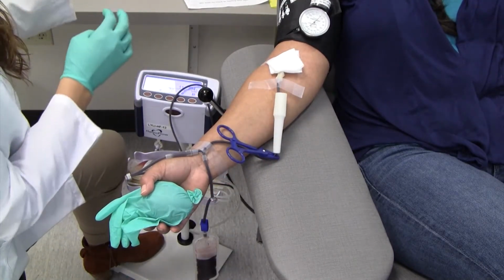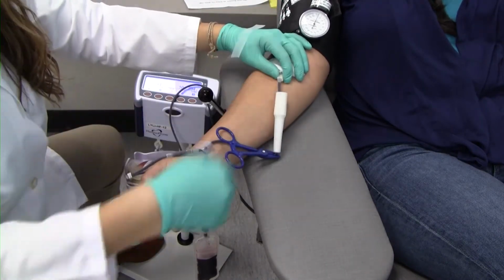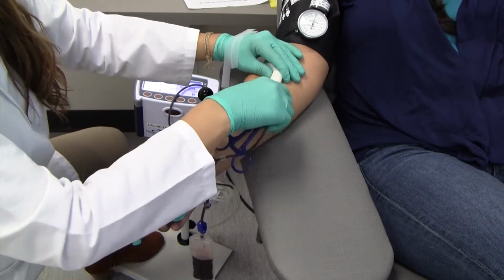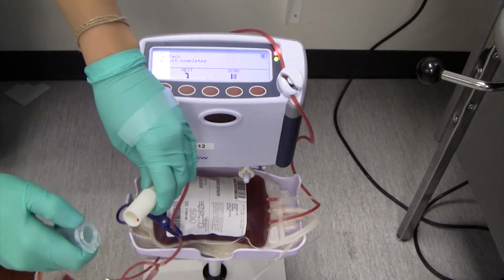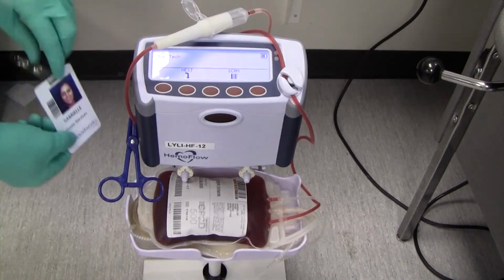Release pressure on the donor's arm. Remove needle using PPD. Ask the donor to raise his or her arm and apply even pressure to the venipuncture site. Insert PPD securely into the vacuum tube holder. Scan employee ID.